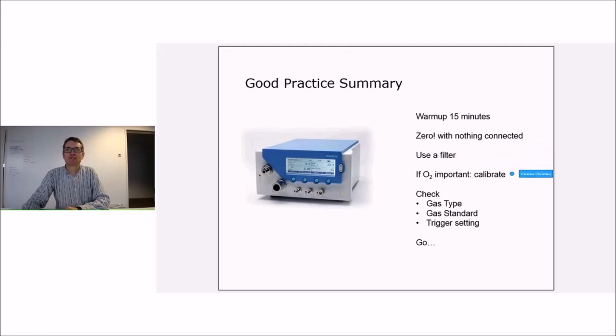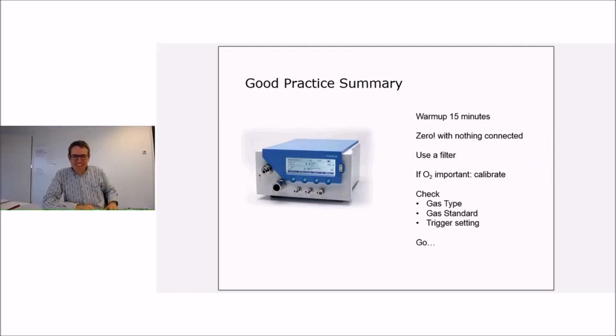If oxygen has any importance, perform the calibration.